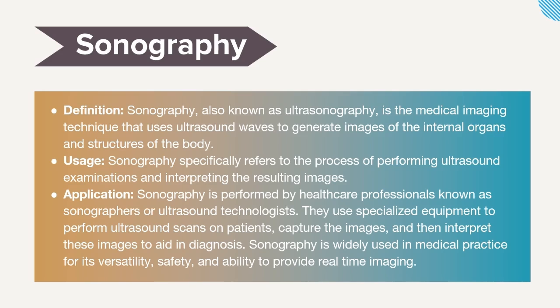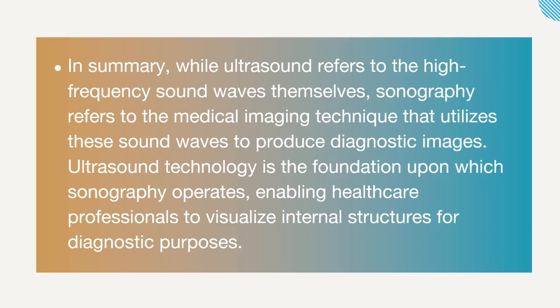It's specialized equipment used to perform ultrasound scans on patients, capture the images, and interpret those images to aid in the diagnosis. Sonography is widely used in medical practice for versatility, safety, and ability for real-time imaging. In summary, ultrasound refers to the high-frequency sound waves themselves. Sonography refers to the medical imaging technique that uses those sound waves to produce a diagnostic image. Ultrasound technology is the foundation upon which sonography operates, enabling healthcare practitioners to visualize the internal structures for diagnostic purposes.